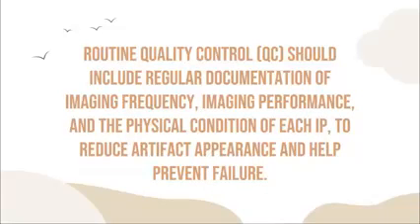So routine quality control should include regular documentation of imaging frequency, imaging performance, and the physical condition of each IP to reduce artifact appearance and help prevent failure. So, yan siya. So kung dili siya makayog interpolation, dapat yun document mo. So, after 10 images, lahi na po ng image. Ang 11th image. So, ang physical condition sa iyong imaging plate, nangalangkat na ang screw. So, that means, basin, maguba na siya. So, dapat quality control and documentation. It's important. Okay?